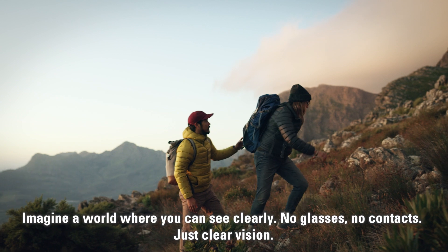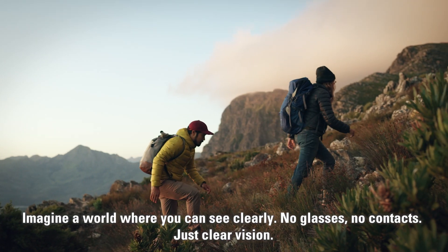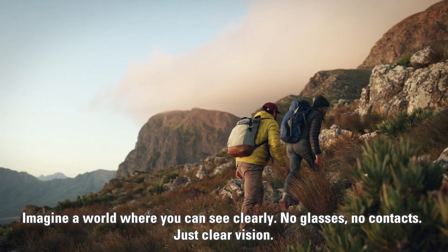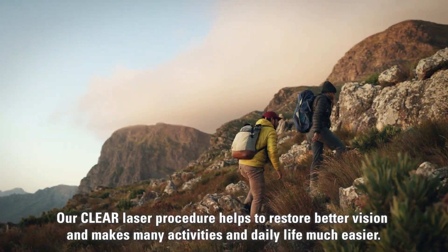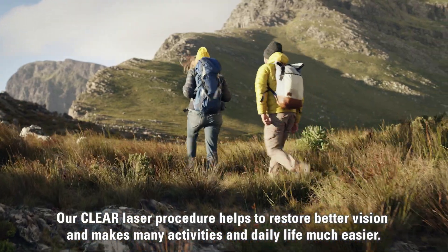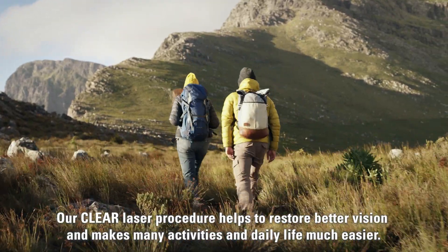Imagine a world where you can see clearly. No glasses, no contacts, just clear vision. Our Clear laser procedure helps to restore better vision and makes many activities in daily life much easier.